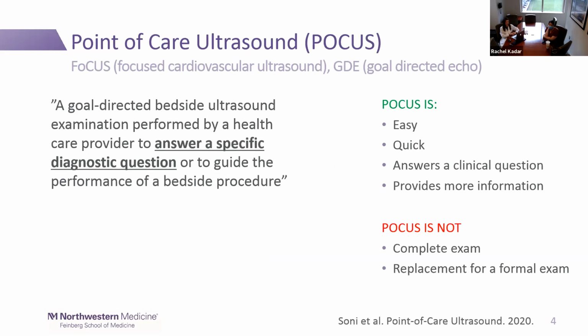POCUS, point of care ultrasound. It's oftentimes referred to, especially in anesthesia, as focused cardiovascular ultrasound, or GDE, goal-directed echo. But POCUS is much broader than that. The definition is a goal-directed bedside ultrasound examination performed by a healthcare provider to answer a specific diagnostic question or to guide the performance of a bedside procedure. As you'll note, POCUS is easy, quick, it answers a clinical question, it provides us more information, it is user dependent, but POCUS is not a complete exam and it's not a replacement for a formal exam.